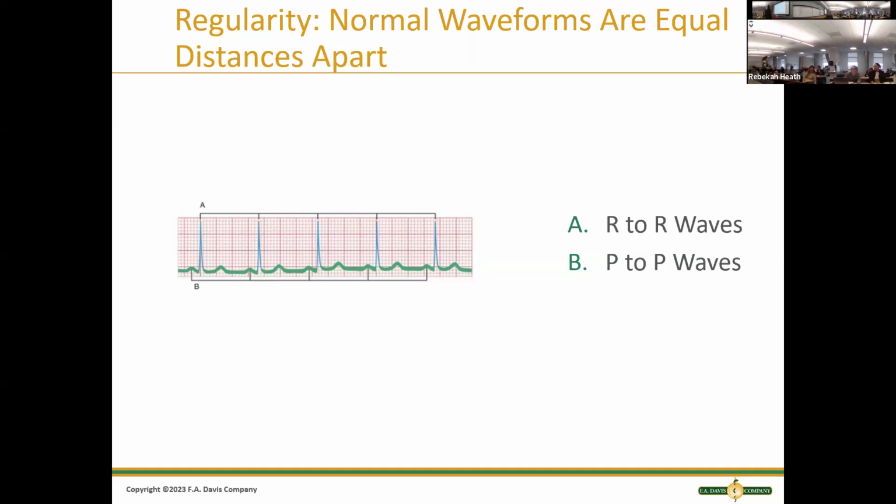All right, so that part takes the longest, to make sure that everybody's on the same page of how we measure. I think learning that paper way of doing it is the easiest because you're always gonna have paper wherever you are. You might not have calipers or some of the other tools. Actually, most of the time, if you ever work in a tele room, now it's electronic and you click. Anybody done rhythm monitoring or tele room? You can click on the rhythm, and when you end, it just says, this is 0.23 seconds or whatever. It gives you the measurements already. But I still eyeball and double check my measurements because I want to make sure it looks right still.